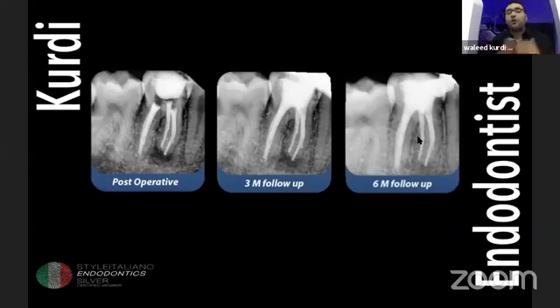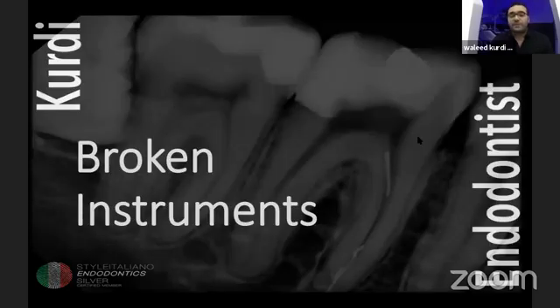And here is the follow-up after 3 months and after 6 months. After 6 months of follow-up, you can even see the complete healing of the lesion, as I hoped. And this case is about 4 years ago, and the patient is very good, touching wood, and everything is fine. So in these cases, if you can bypass it right, you will have great results.